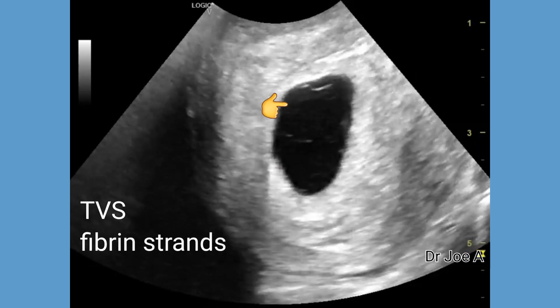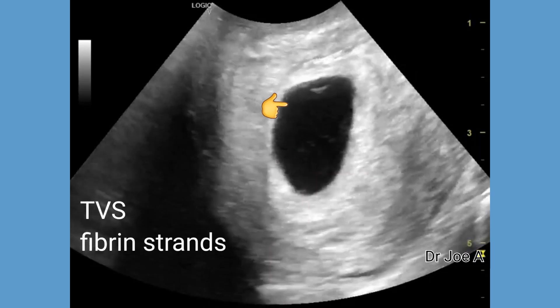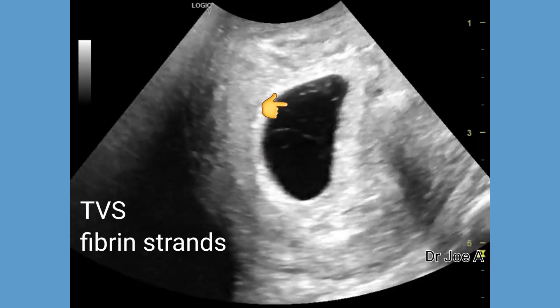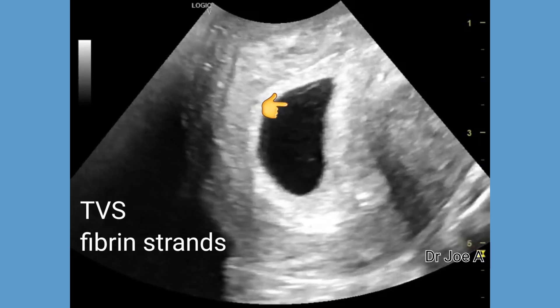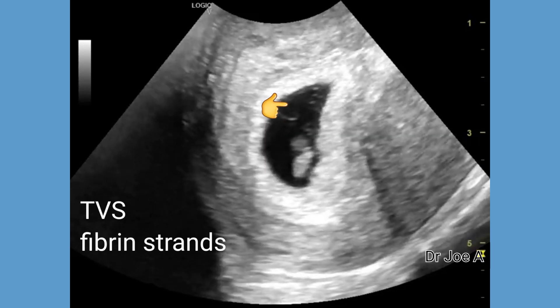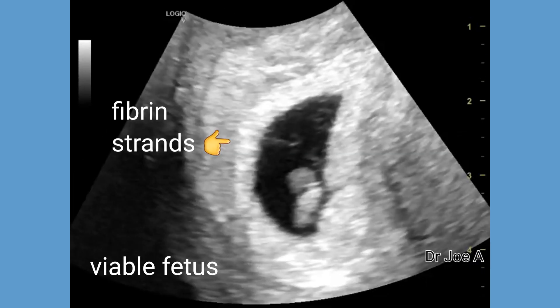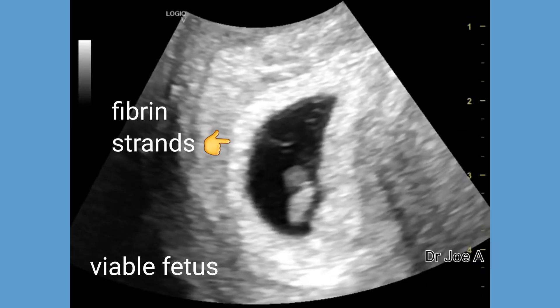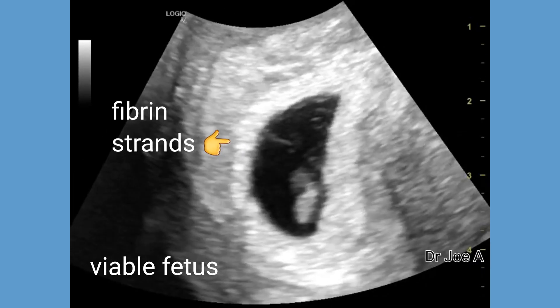The question that arose was: are these early amniotic bands or something else which may not be significant? Amniotic bands are usually not seen at such an early stage of pregnancy, and hence we think that this may be something called fibrin strands — a benign condition.